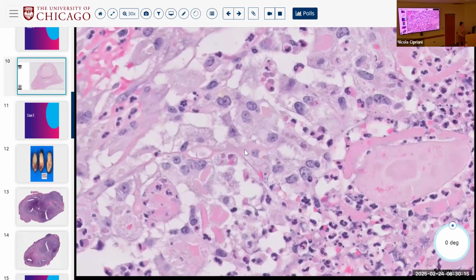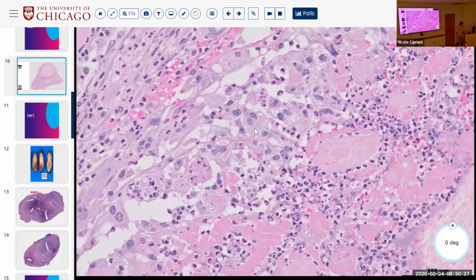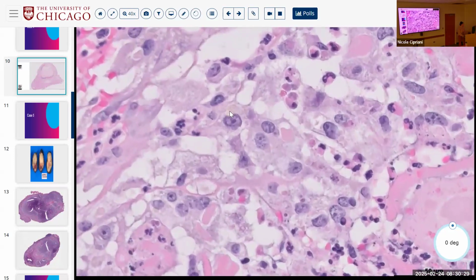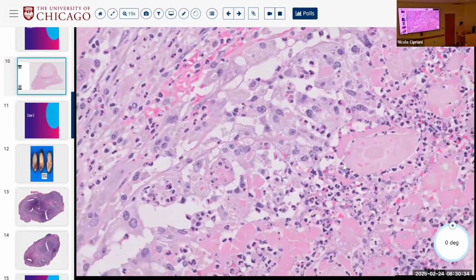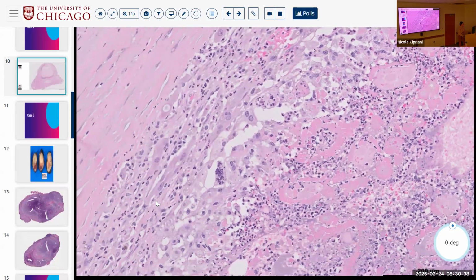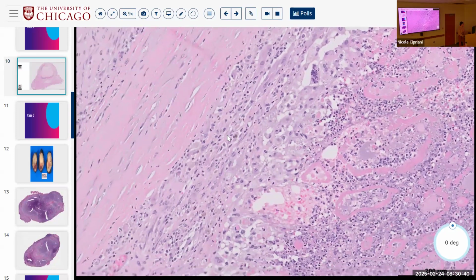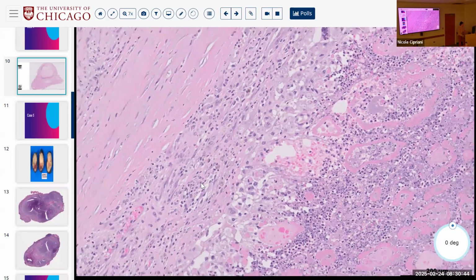Yeah, I don't know. If I wasn't in the thyroid, I'd say oh, it's macrophages. It's not the architecture of it, but maybe if you have macrophages, it's so foamy. Yeah, it's really foamy, right? And there's this yellowish material in some of them. So I think a lot of those are histiocytes. And there may or may not be some residual follicular epithelial cells at the periphery that are compressed that you were pointing out with those big nuclei. But I think a lot of the viable periphery is histiocytes. Okay, cool.